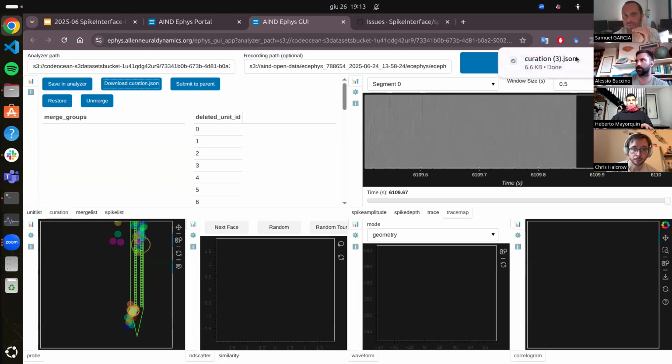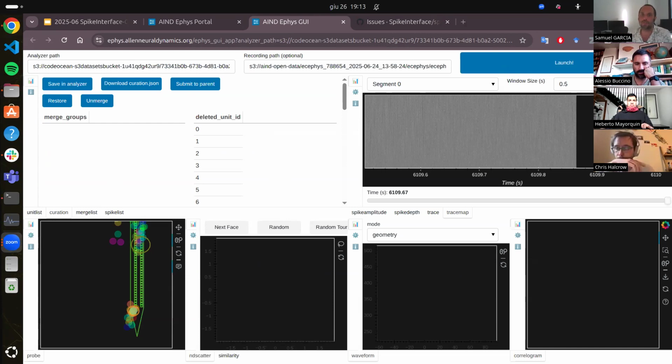So here the question is to extract the spikes. The idea is you load back your analyzer in Python, and the analyzer has access to the spikes. So there's an API. You need a bit of code in Python to make the spikes in the format you want. The internal representation of spikes is quite efficient. In short, the analyzer contains the spikes in several ways, by dictionary or by two columns, or both at the same time, which is good for processing. And we have exporters to other data formats.